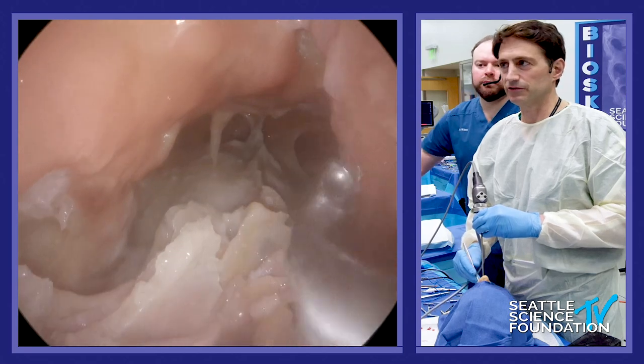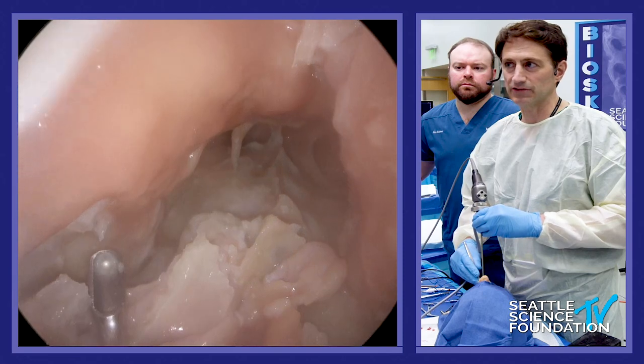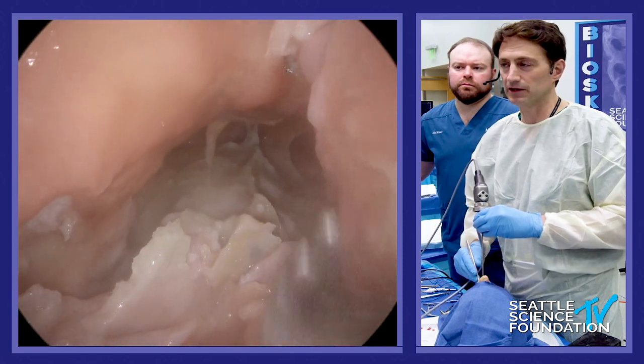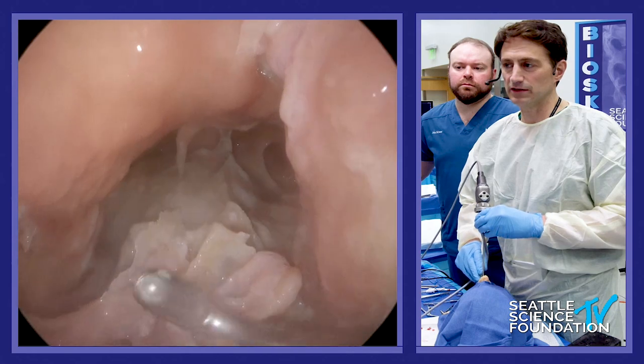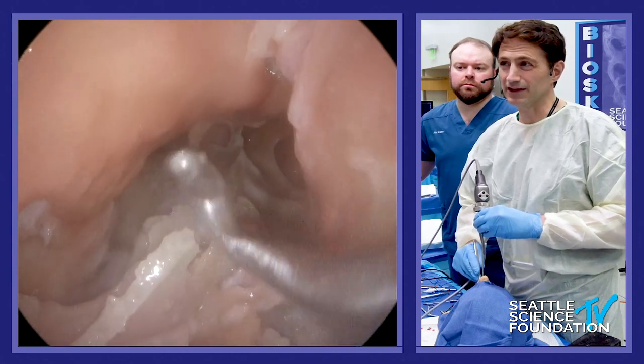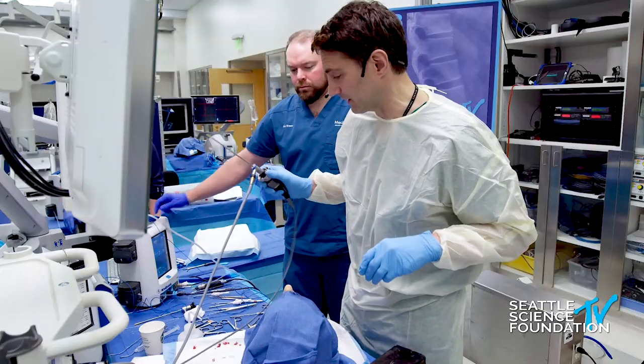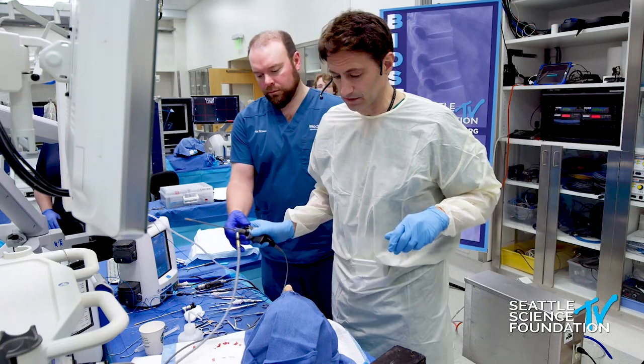I always like to put Solastic up here to cover these flaps. This is a very nice technique. You'll see in videos — at five, six weeks there's no exposed bone whatsoever. In a lot of instances, by two weeks. And that's it.